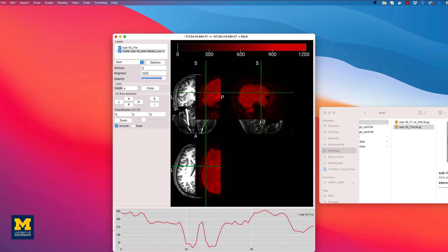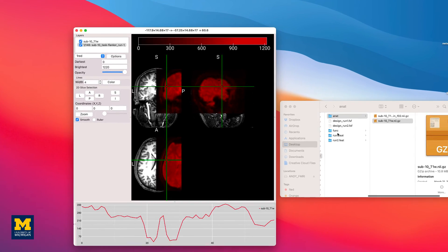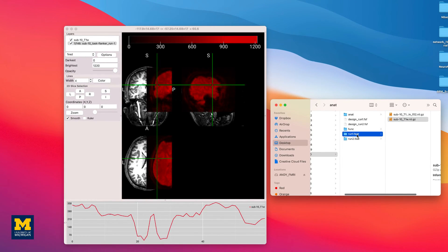In this case, the images are quite far away from each other, with the functional image highlighted in red. After you've run co-registration and normalization, you can use MRIcroGL to evaluate how well the functional and anatomical images are aligned, and how those images in turn are aligned to standardized space. If you've run your analyses through FSL, for example, you can find the output from these steps in the reg directory from your feat folder.